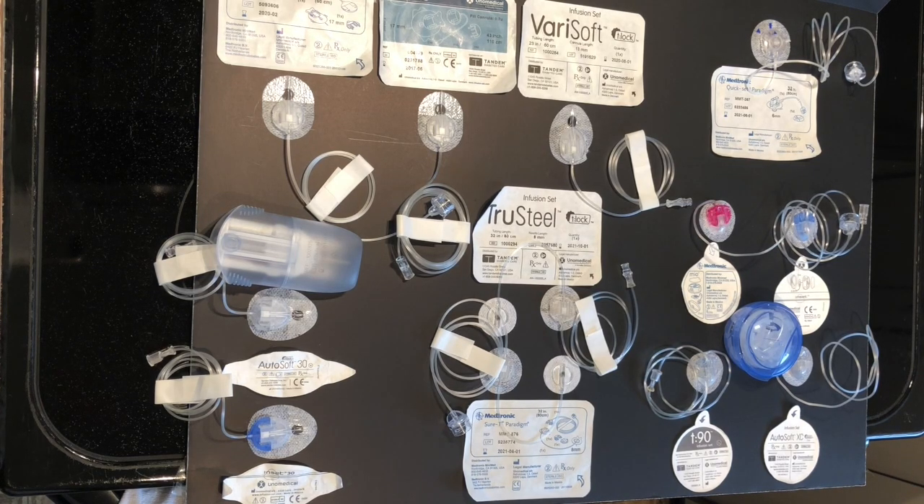Hi, this is Alisha, one of the educators at Integrated Diabetes Services. I wanted to share some diabetes life hacks with you. In my diabetes management it's not the big things that make a big difference — it's a lot of little things that just make diabetes easier. One of the things I found that makes my life a lot easier is figuring out how to hack my infusion sets.